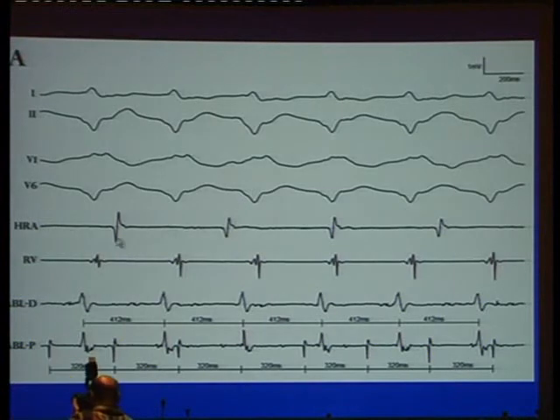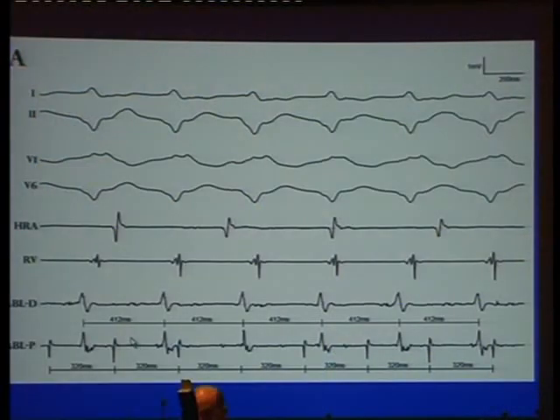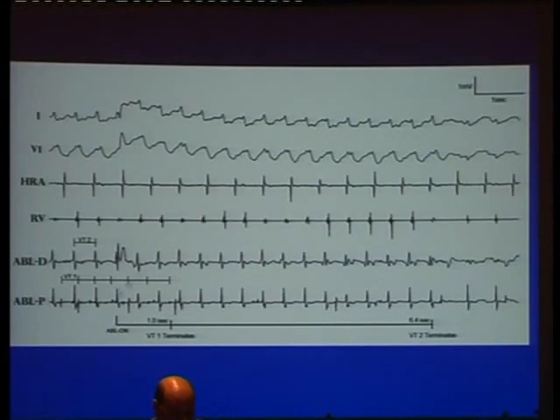So here we are in ventricular tachycardia. We're mapping with our ablation catheter. Cycle length of the VT, 412 milliseconds in the critical. But look at this. On the proximal electrode, very strikingly, there's the VT, the predominant one, manifest. And within it, there's another electrogram marching through dissociated at 320 milliseconds. So in fact, what this was, 2 VTs linked together with a concealed VT intermittently resetting the manifest VT.